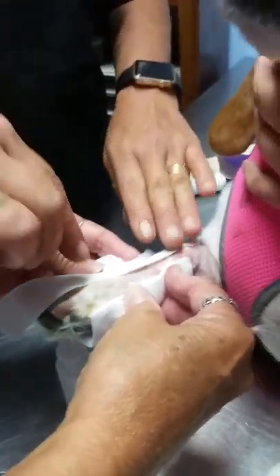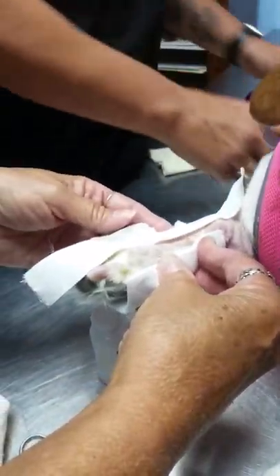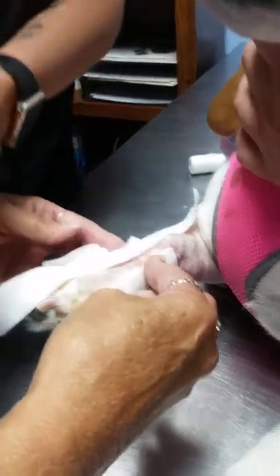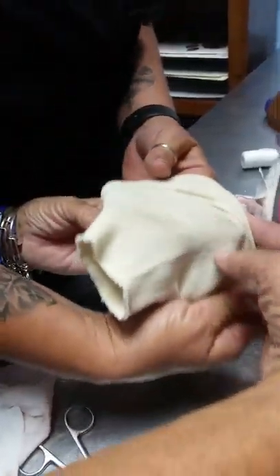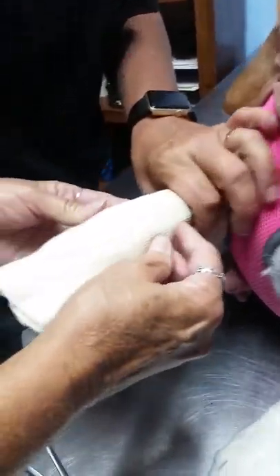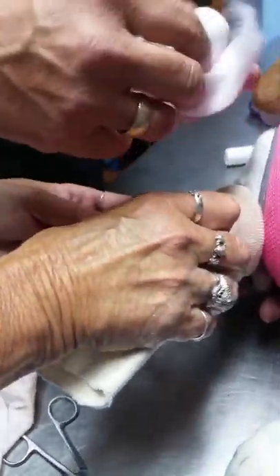This time, since we've done two every other time, we're only going to do one, which is on the front side because there hasn't been one here. Then I'm going to put almost a little sock on just to hold everything together.